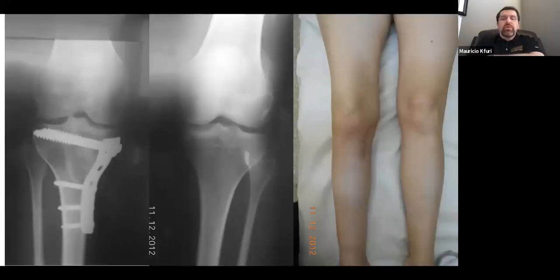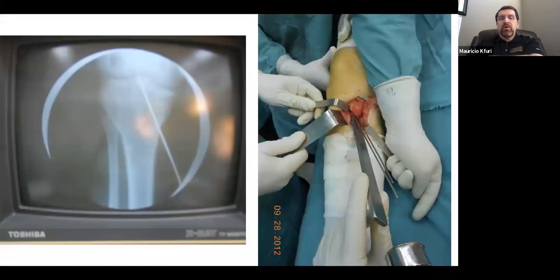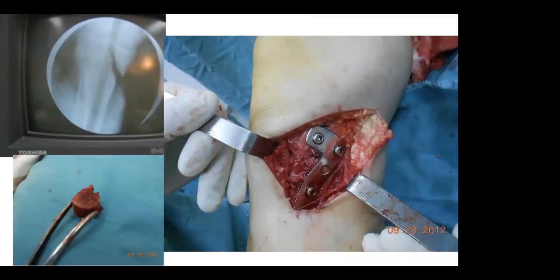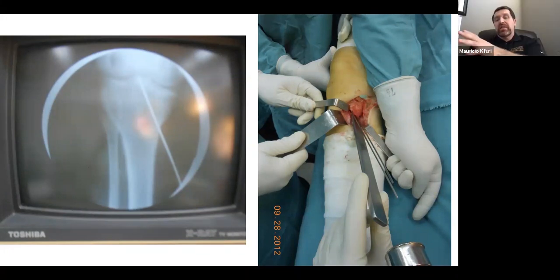I think that gives you more. If you go back to the surgical approach there, or maybe there. Which one? The previous one, please, Michael. It looks to me like you can see the anterior medial aspect of the tibia. And to see this way, you may have to lift the MCL.